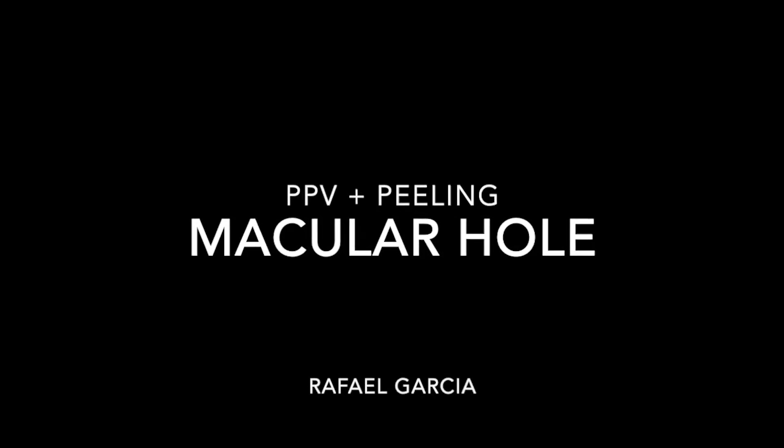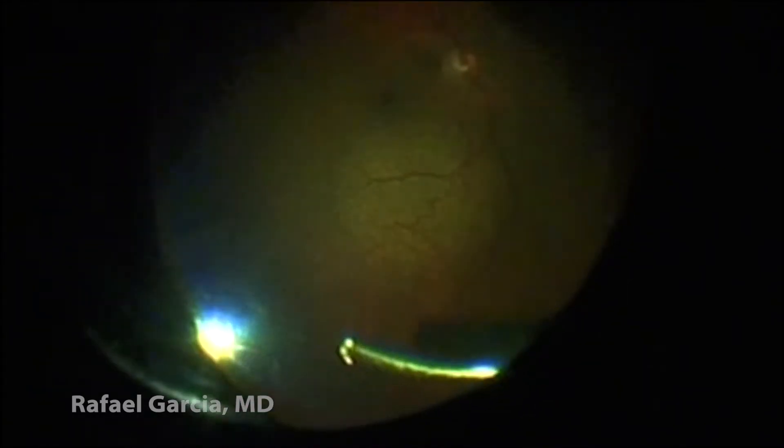This video shows an idiopathic macular hole treated with a pars plana vitrectomy. At first, the anterior vitreous and the vitreous core are addressed.